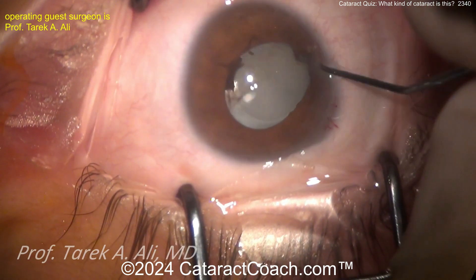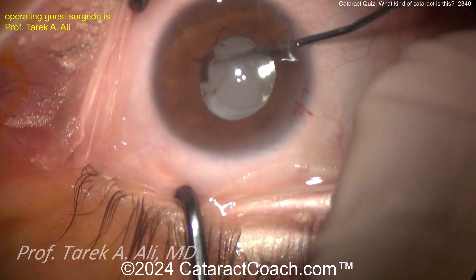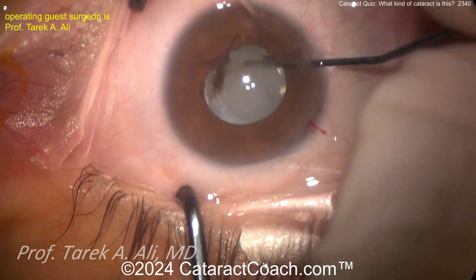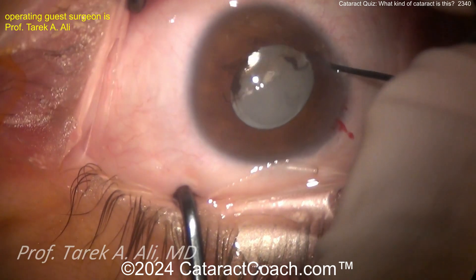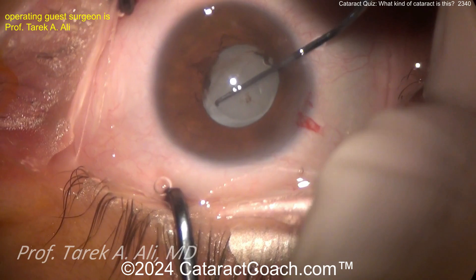Now you've got to carefully dissect the IOL out of the capsular bag. When you break the synechiae, that's good — get that pupil to expand a little bit more, maybe a little pupil stretching. To get the IOL out of the capsular bag you've got to be very careful, because ideally you're going to put the new IOL back in the capsular bag.